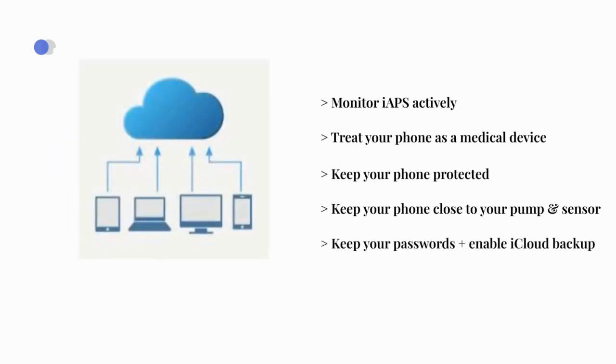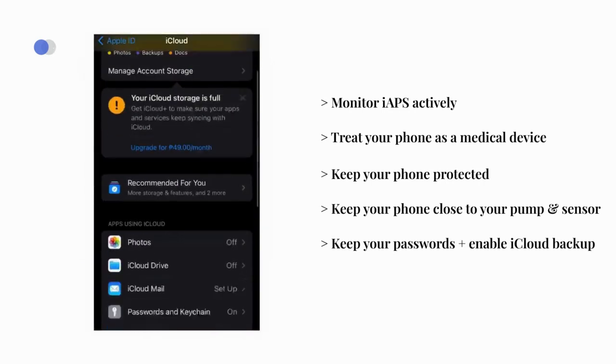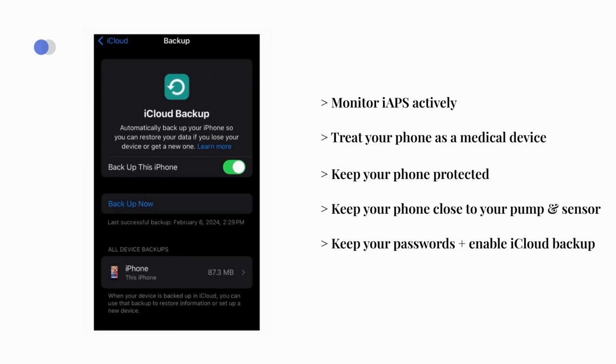Passwords and backups. Keep a record of all passwords used and store a backup of your app in iCloud. Enable the automatic backup of your iPhone to iCloud to have access to your personalized settings whenever you have to update or reinstall your iAPS app.